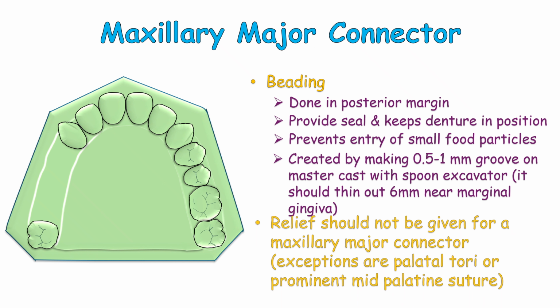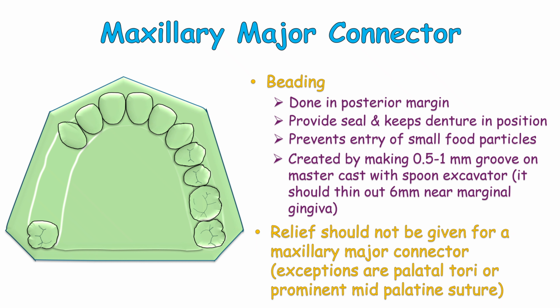In most cases of maxillary major connector, relief should not be given unless there is palatal tori or a prominent mid-palatine suture.